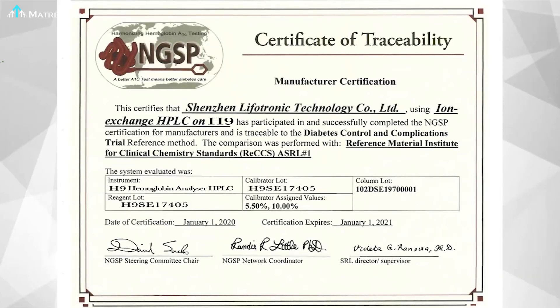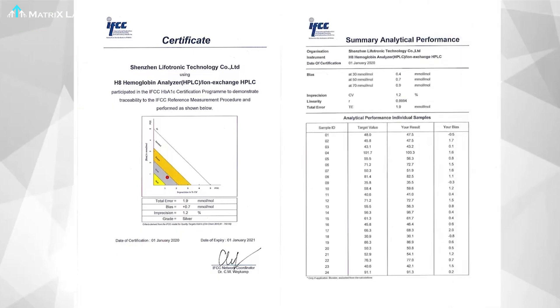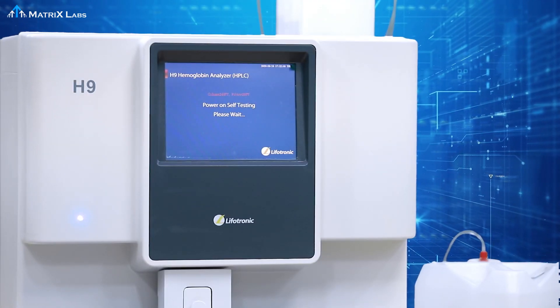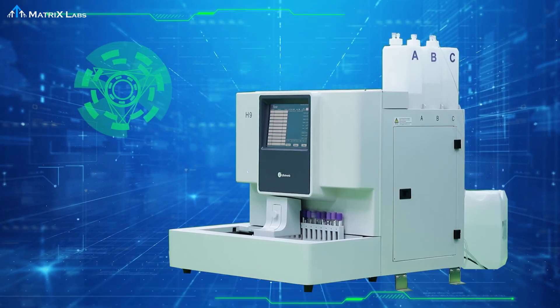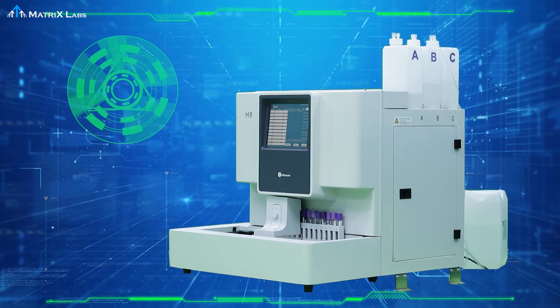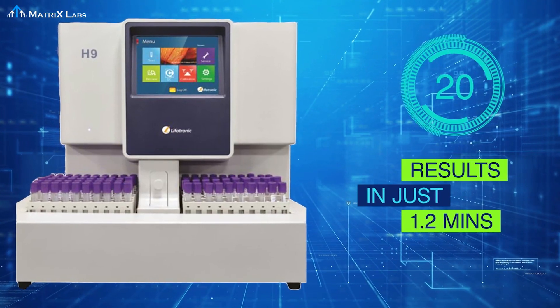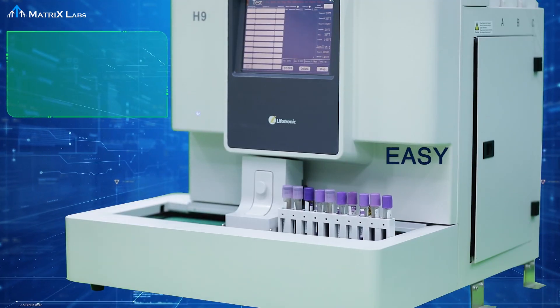H9 is certified by NGSP and IFCC for HbA1c analysis. H9 works on a high operating pressure of 6 to 12 MPa and offers the fastest available throughput of HbA1c results in just 1.2 minutes, with an easy sample loader.